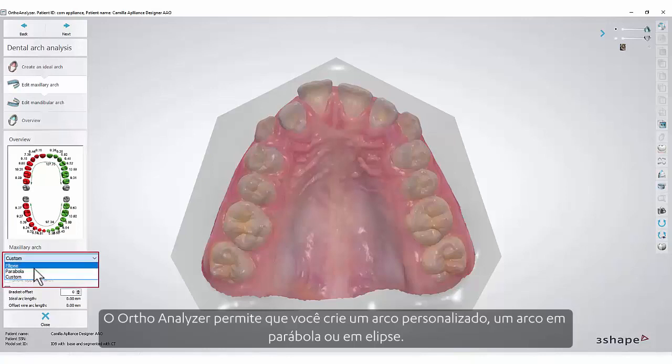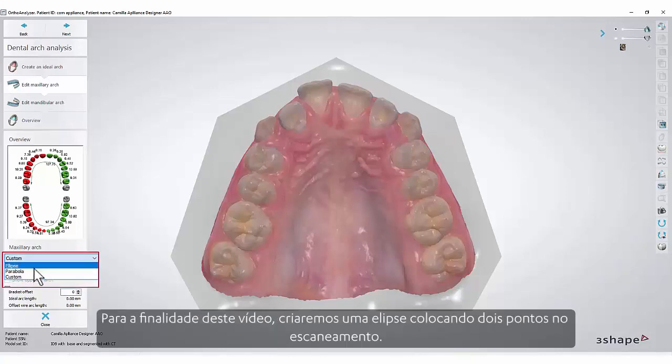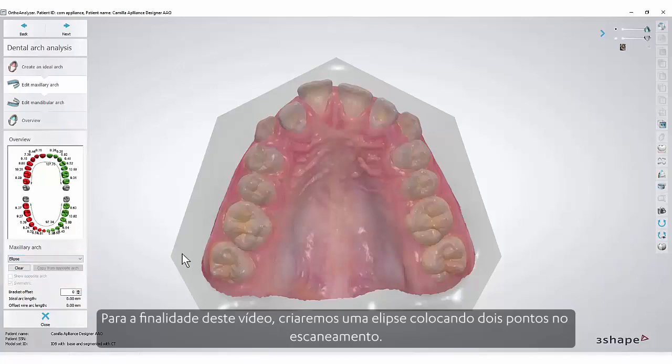For the purposes of our video we will create an ellipse by placing two points on the scan.